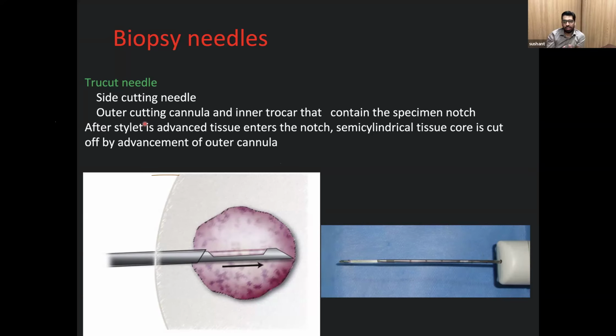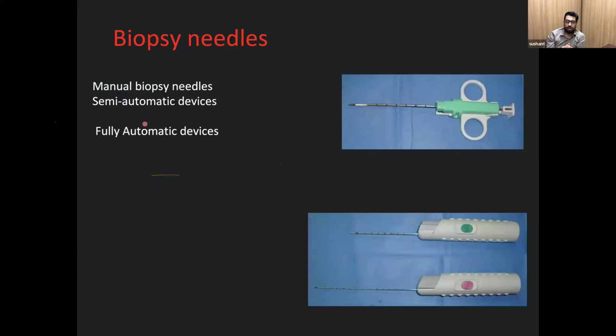As compared to the liver, the biopsy criteria are that we have to use at least 2 centimeters of 18 gauge biopsy sample, and it should have more than 11 portal triads on a slide. So that is the adequacy needed for different organs to get an adequate sample. Depending on the organ, the gauge size, and the lesion, we change the biopsy sizes, the needle sizes, and the length of the biopsy guns.